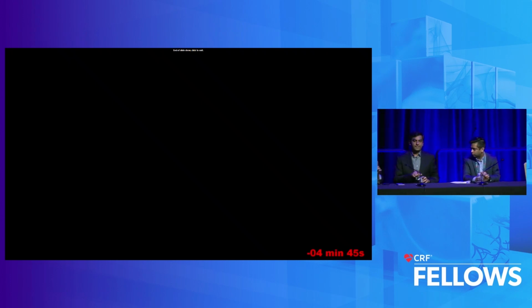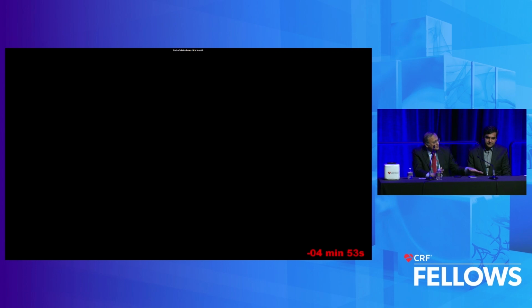So I'll close out in a minute, so you have some time, but I want to take some questions. So I'm going to pose another question. If the first wire, your Sion Blue, as great a wire as it is, went subintimal, what would you have done next?